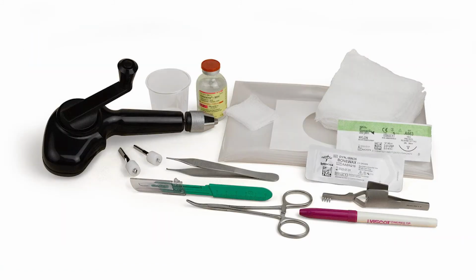Use a pair of forceps to remove any bone dust or chips, as these can get passed into the brain tissue during catheter insertion. Once the burr hole is made, use a needle or number 11 scalpel blade to puncture the dura.